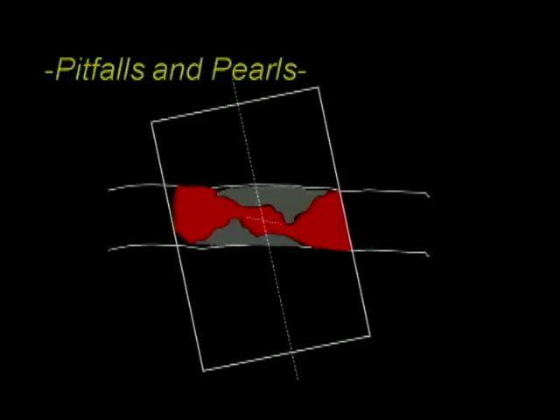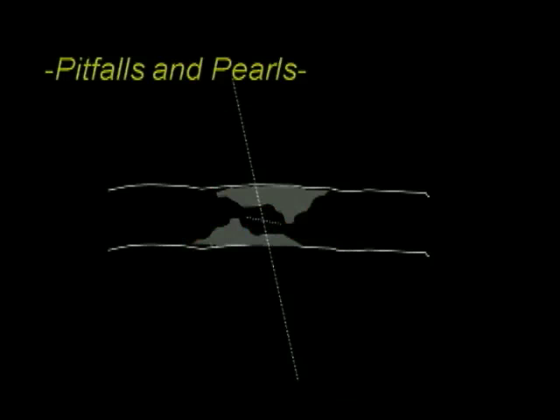But if you look closely, although it's aligned to the flow of blood as determined by the color flow image, if you turn off the color, you can note very quickly that that Doppler angle really is not aligned to the vessel wall, and in fact really should be aligned the way the yellow line there is aligned. If we remove the original beam angle, you can see now that we are parallel to the vessel wall. So I would be careful and caution you, probably use the color to identify the stenosis, turn the color off, and then sample the vessel without the color flow image.